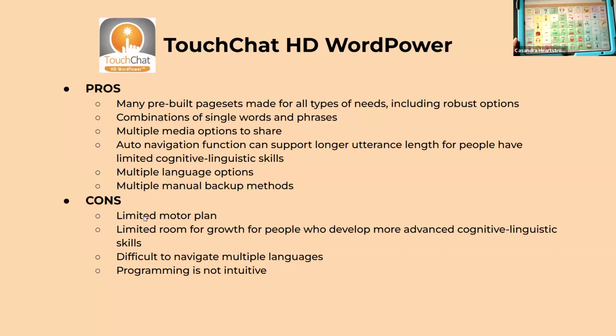Some cons: it has a limited motor plan. In Touch Chat, things move around on you a lot. Right now, those pronouns stood in the same place. But on different pages, you will have the same word in a different place. So there are words that are on multiple pages, and on those pages, they're not always in the same place.